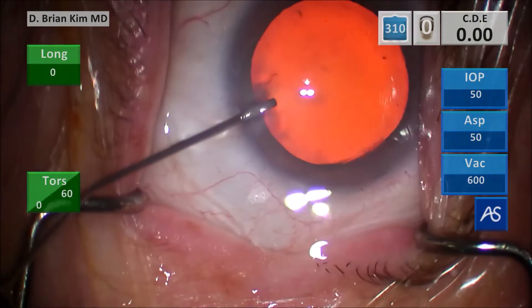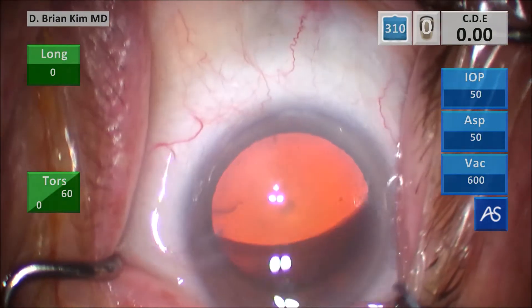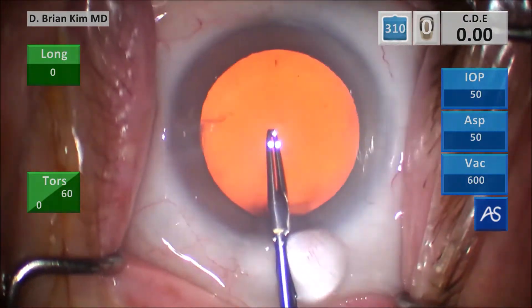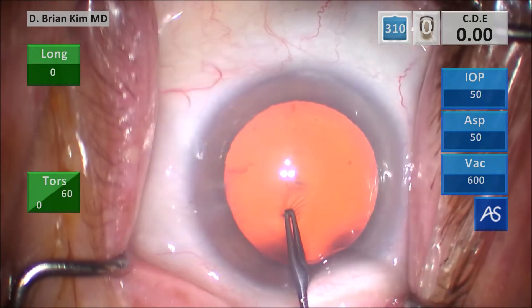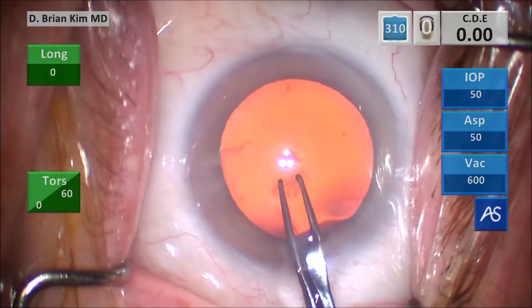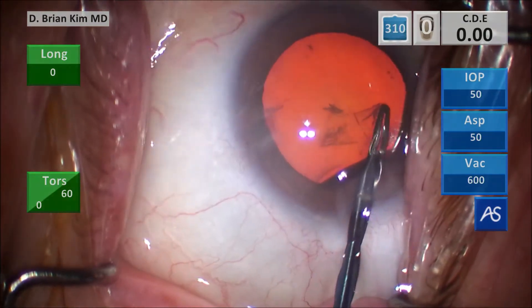When I operate, I tilt the head temporally significantly and turn the head towards me, giving myself the best advantage to get rid of that pooling water, but you can see how much water there is pooling. This is a sharp tip Haldipurkar forceps. I puncture the capsule centrally, pull down, grab the right side of the tear, create a flap, and then go around circumferentially, trying to make the rhexis size and shape which will match that corneal mark I made earlier.